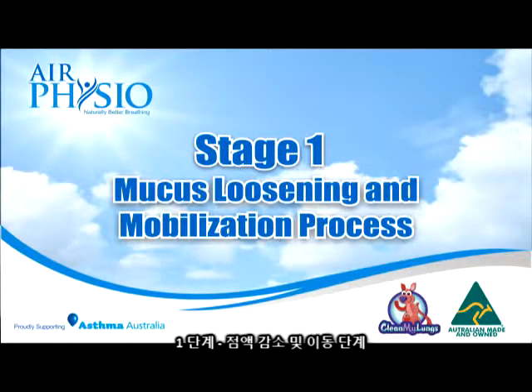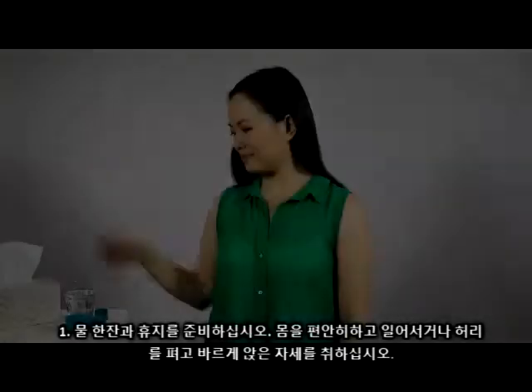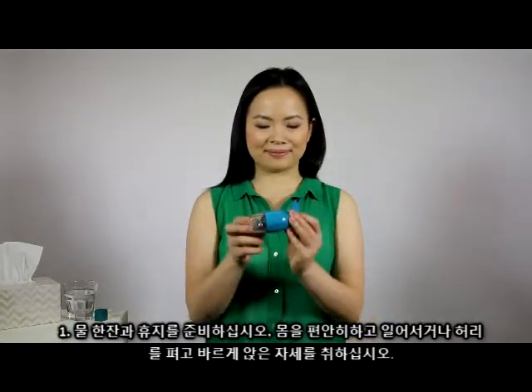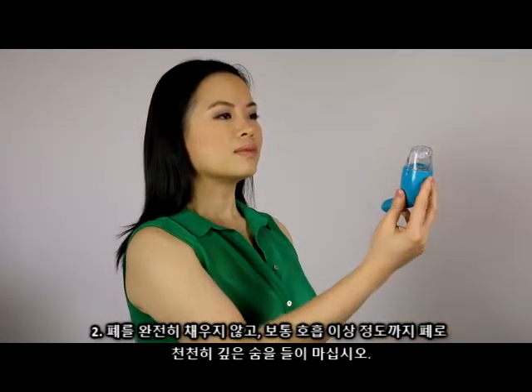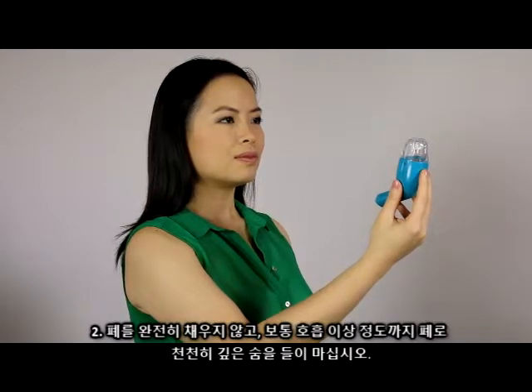Stage 1: Mucus loosening and mobilisation process. Step 1: Gather a glass of water and tissues, relax and assume either an upright stance or an upright sitting position. Step 2: Take a slow deep breath into your lungs to the point beyond the normal breath, but do not fill lungs completely.